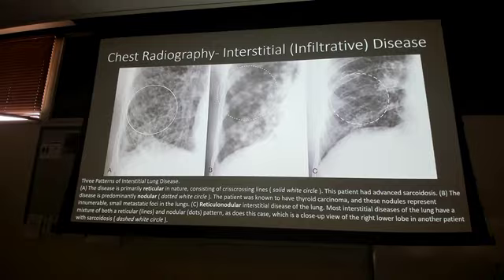Sir, question about the ultrasound and placement of the ultrasounds. It says indication. What makes it a positive exam? Are you looking for the posterior sign? Nope, the slide with the locations of where to do the ultrasound is just to show you where you would do the ultrasound for all those areas of the EFAST. The indication for a positive exam is the pictures that I showed you that show the fluid where it's not supposed to be. It has nothing to do with the locations of where the ultrasound probe is on that one slide.